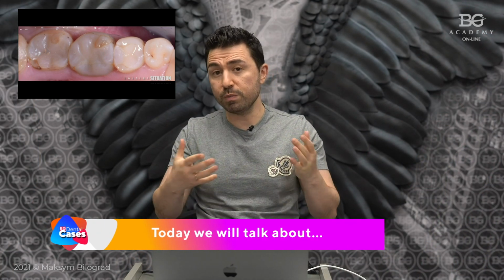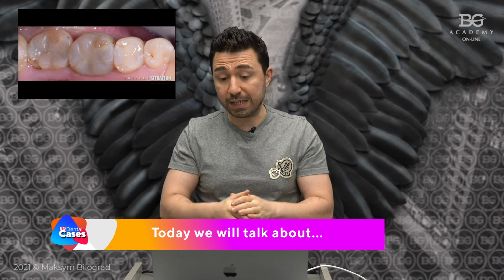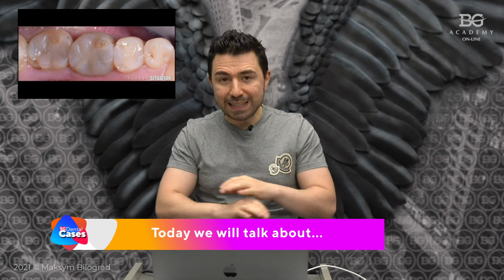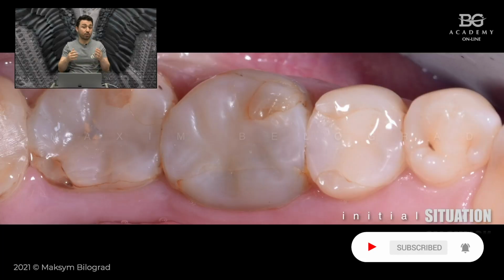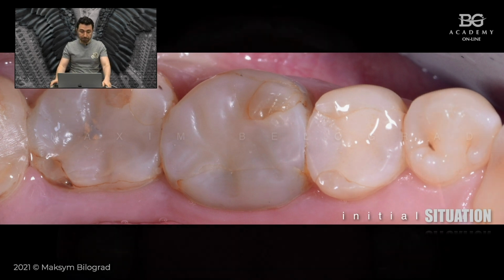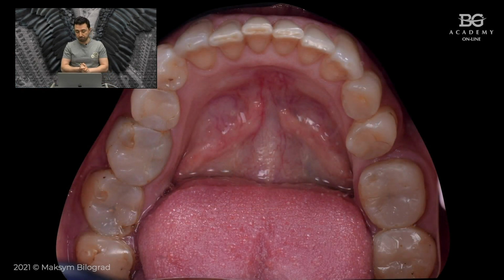This time our new BG Dental case is dedicated to a very interesting clinical situation, when a tooth was completely destroyed by caries, at gum level, actually somewhere below the gum, but the tooth was vital. I had a very strong and big dilemma inside myself in choosing the technique of restoration of such a tooth. So let me show you exactly the case.